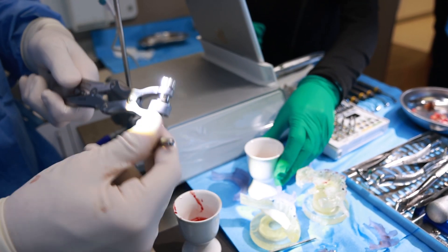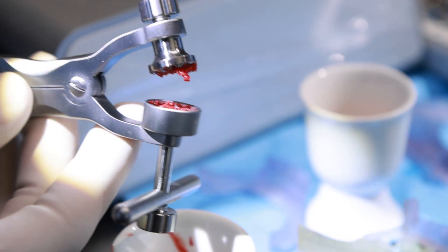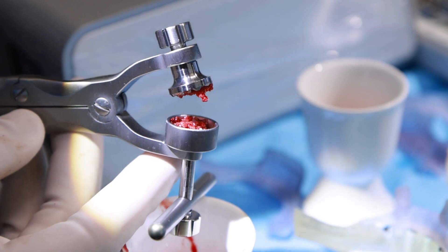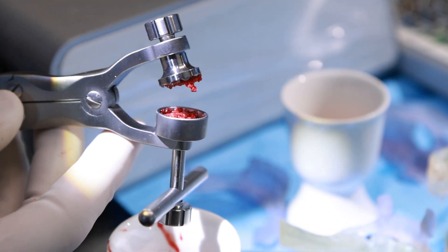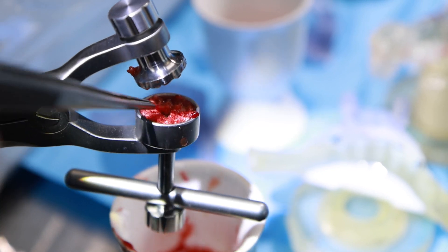I used the double action mill on a recent full mouth case and man did it work well. Within just five or six seconds of grinding, the bone became a beautiful, consistent particulate that I could then place into the deficiencies inside the dental arch. I think Hugh Freedy may have also made some improvements to the grinding action of the mill itself — I found that the bone I ground up was remarkably similar in consistency to bottle bone, making it very easy to work with in the patient's mouth.